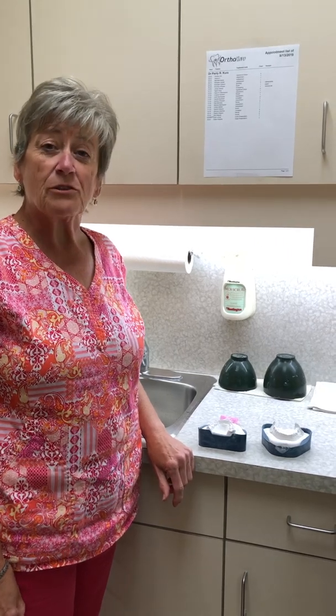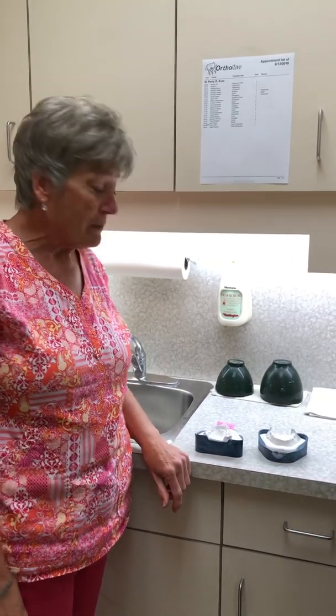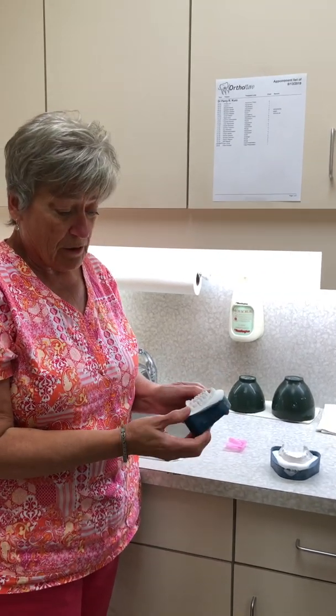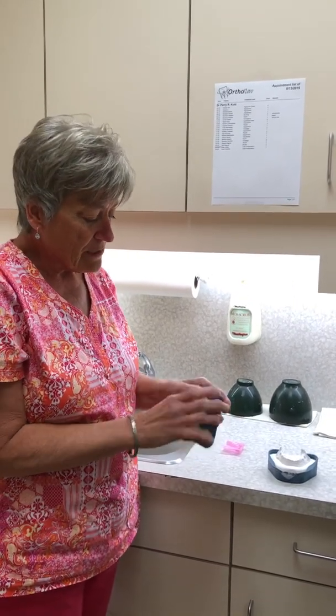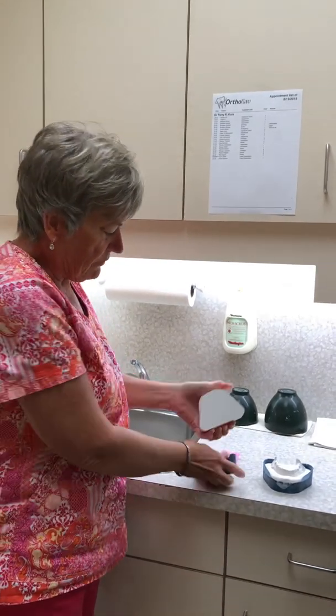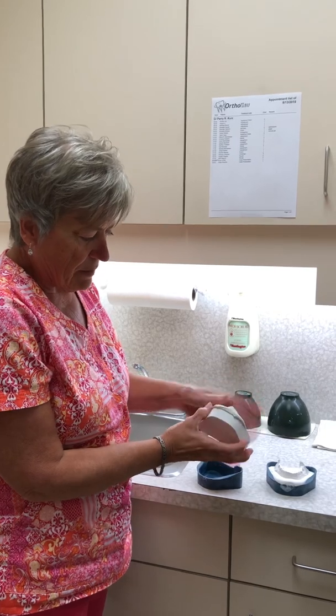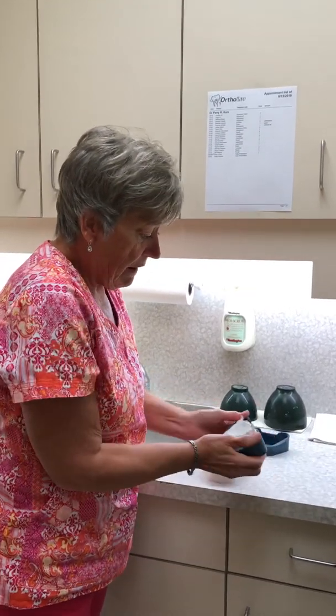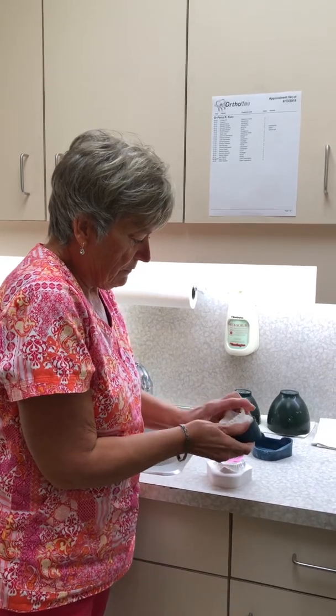So today we're going to learn how to trim an orthodontic model. All right, we've taken our molds, we've poured them up, and now we've got them in our bases. We're going to take them out of our bases. And it's always nice when you do an orthodontic model that you have a little bit of an extra lip, easier to grab onto when you're trimming, easier to take out of your mold. So we'll pop both of those out.